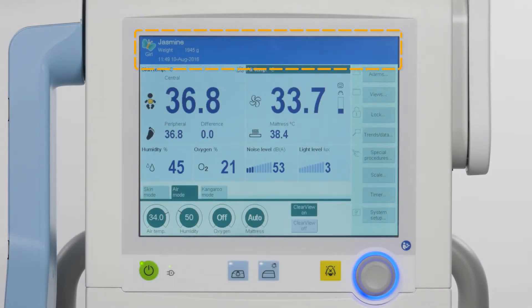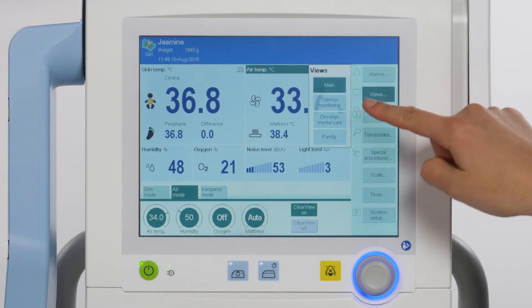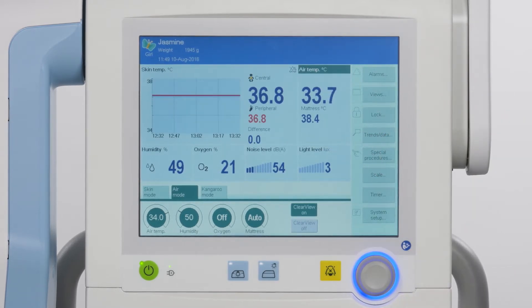The main screen includes the header bar, all alarms, both message fields and resets, therapy bar, monitoring area, and the main menu bar. You can also monitor the baby's central and peripheral skin temperature when temperature probes are used. Thermomonitoring continuously measures and displays the infant's skin temperature, even when skin temperature mode is not active. Switch to the thermomonitoring view to see the trend.